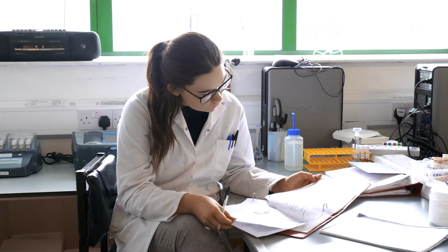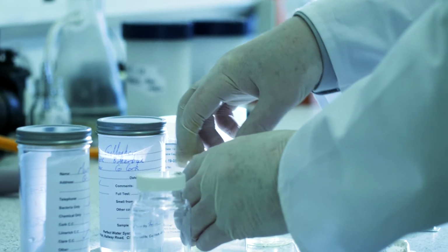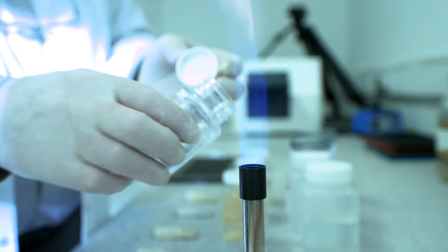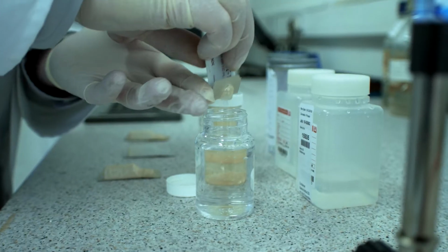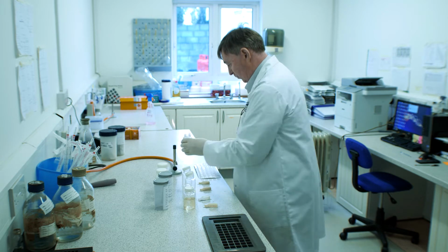Testing for water quality is broken down into 5 suites. Number 1. The bacterial suite. This suite includes the bacteria tests for coliforms and E. coli to determine if the water has harmful bacteria arising from contamination by sewage and human or animal wastes.